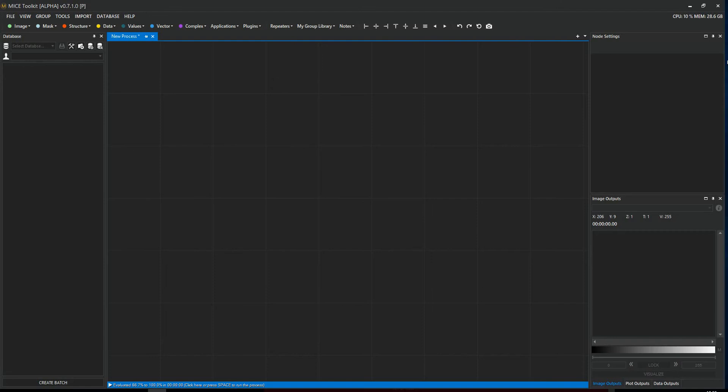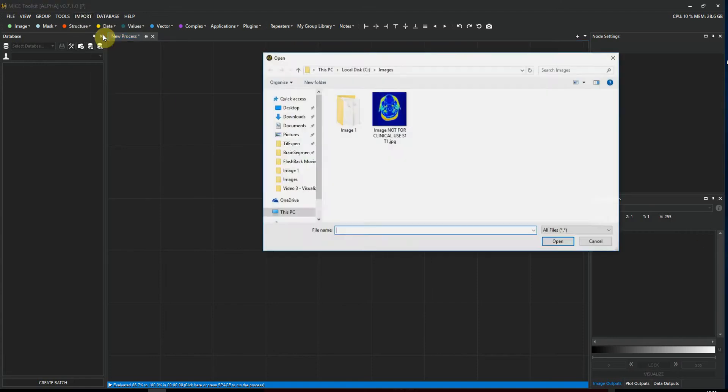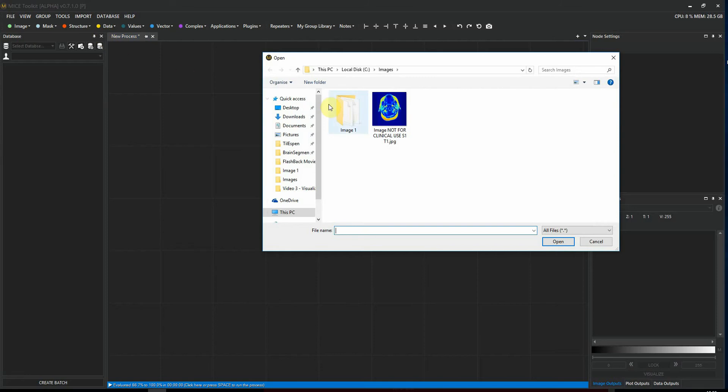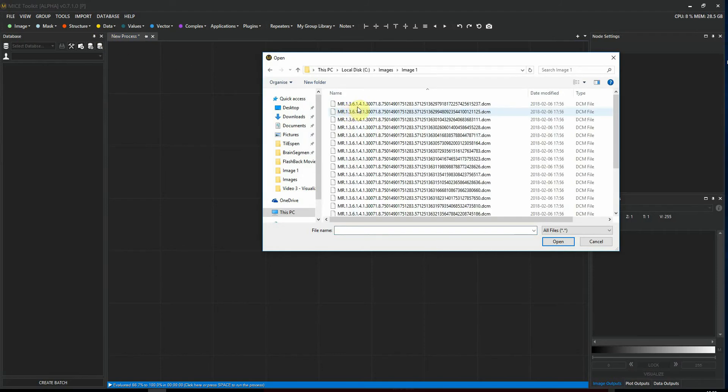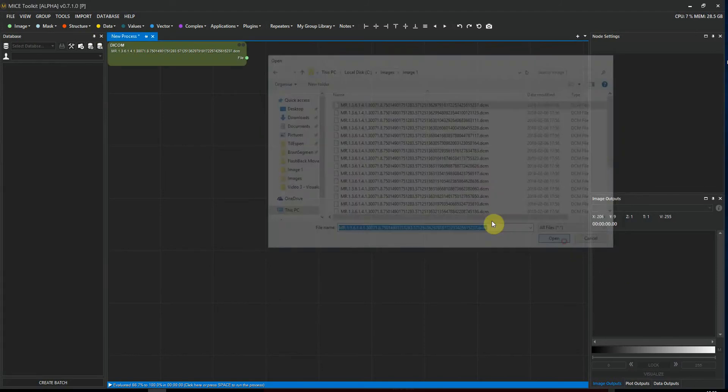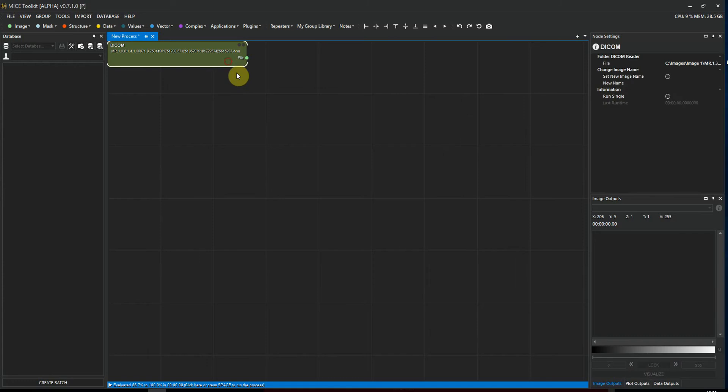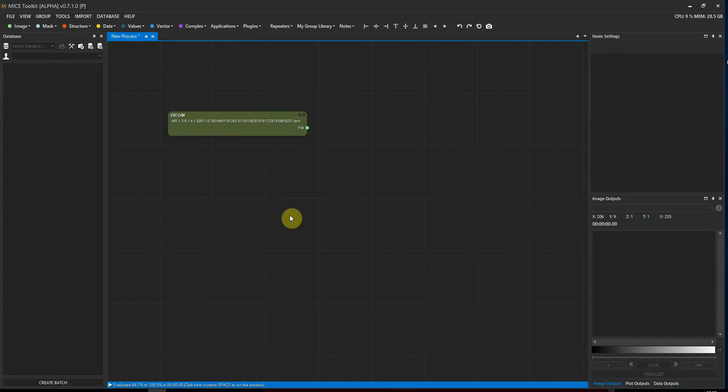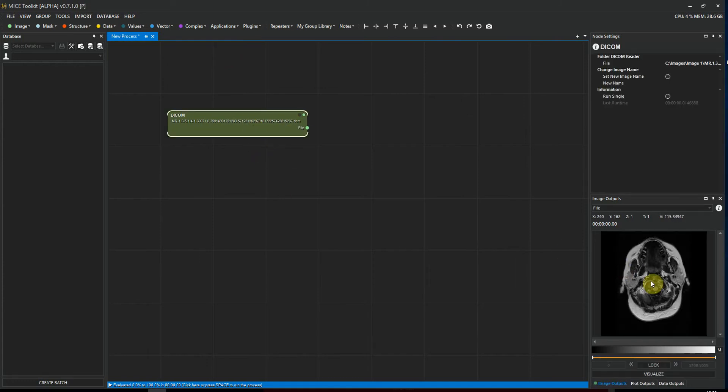First, I'm going to show you how to import a single DICOM slice. We can do that by going to Import DICOM Files, and then you select the image, the DICOM file that you want to import. Click Open, we execute the workflow by pressing spacebar, and we see that we have imported one slice.